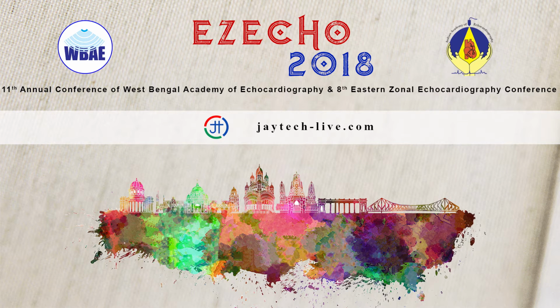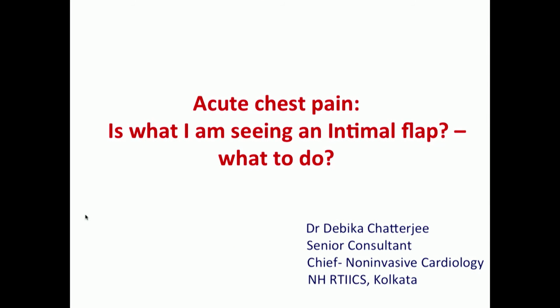So in this doubt clearing session, my responsibility is to present on echocardiographic findings of acute aortic dissection. The title goes like this: acute chest pain. Is what I am seeing an intimal flap?